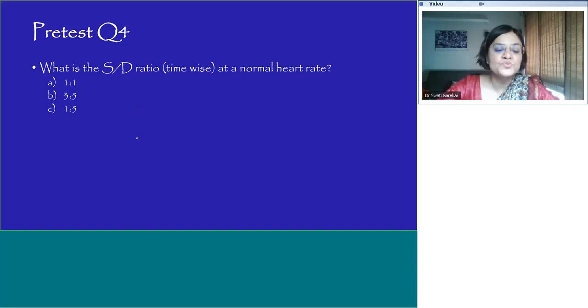Next question is, what is the systolic diastolic ratio time-wise at a normal heart rate of 75? Systole diastole ratio. So is it 1:1? Is it 3:5? Is it 1:5? What are your thoughts on that? Somebody says 1:1. I'm happy people are replying. Somebody says 3:5. Somebody says 1:5. So again 33%.